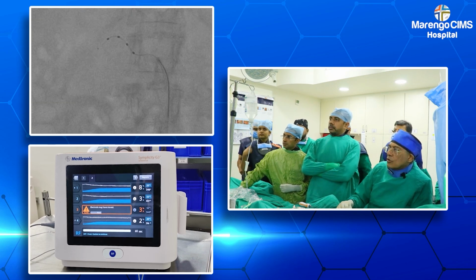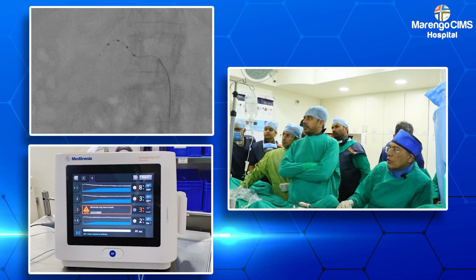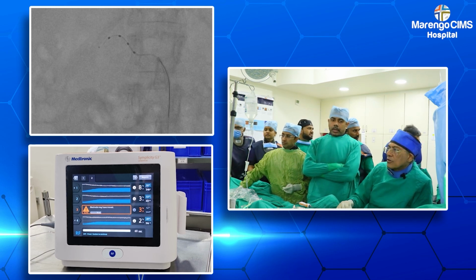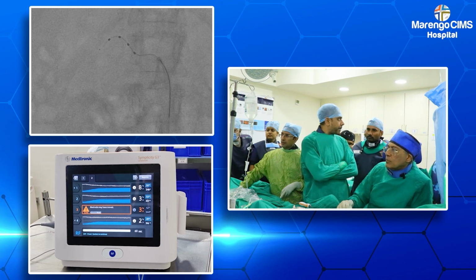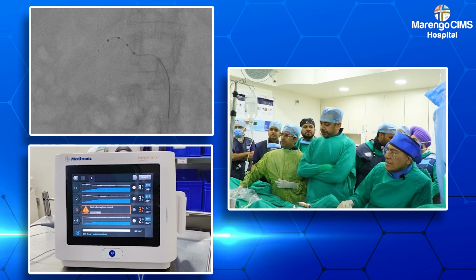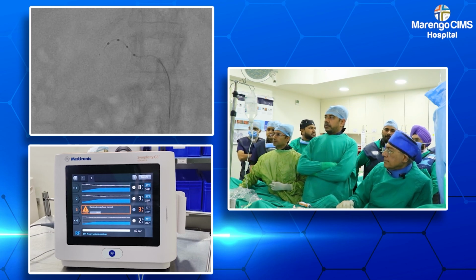The second electrode had partial ablation with some degree of loss of contact. The third electrode, the sensor in the console felt it had moved and discontinued and stopped. And the last electrode did ablate again to a lesser degree.